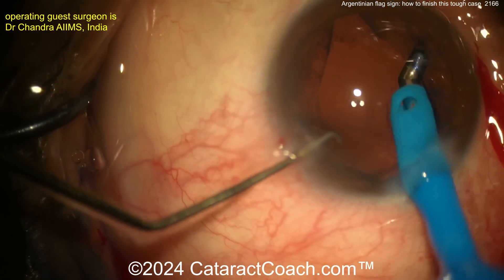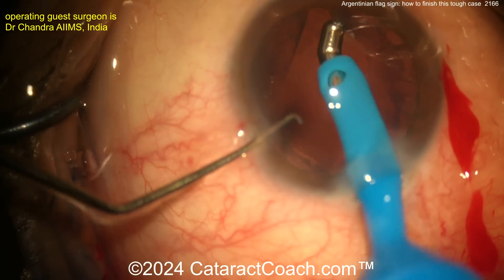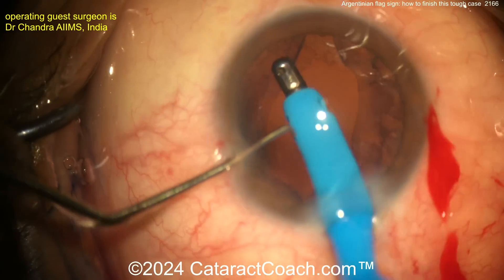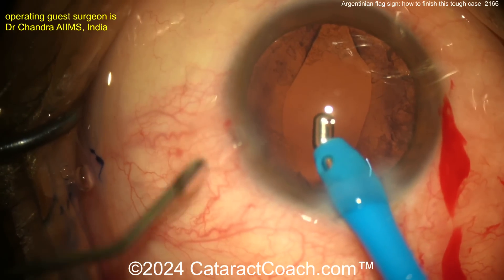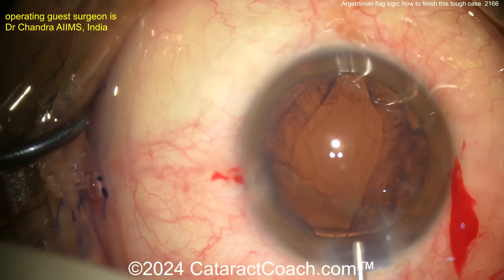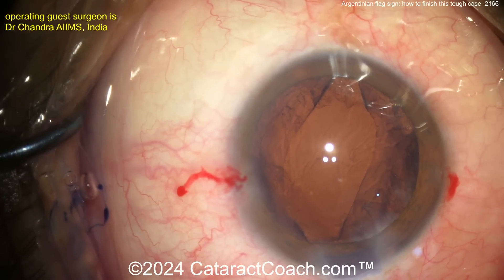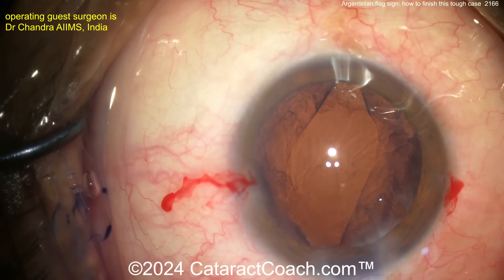Taking your time here — remember, don't pull on the capsule, especially because you don't have a full-size rhexis. It's kind of a small, irregular shape. You've got to be very cautious here. I would not do too much lens capsule polishing. The good news is patients with a white cataract have pre-op vision of probably hand motion, or wind perception if you move your hand fast enough.